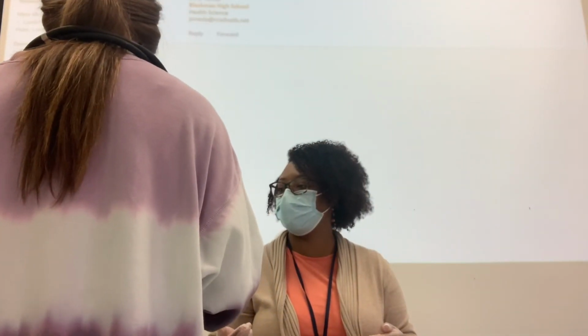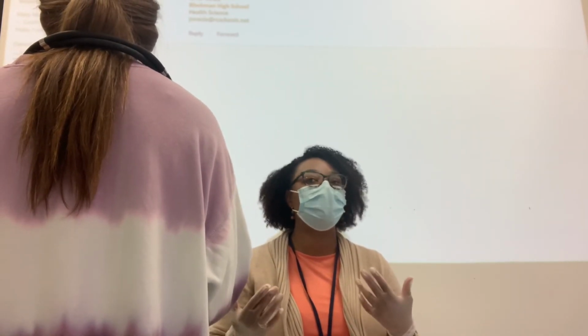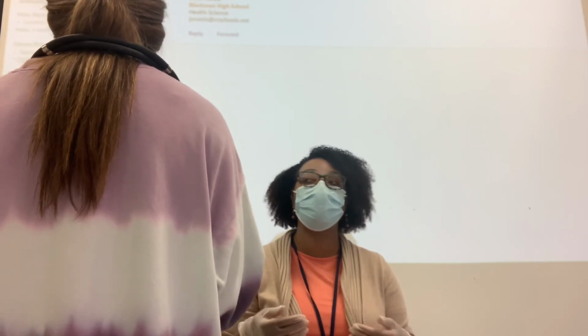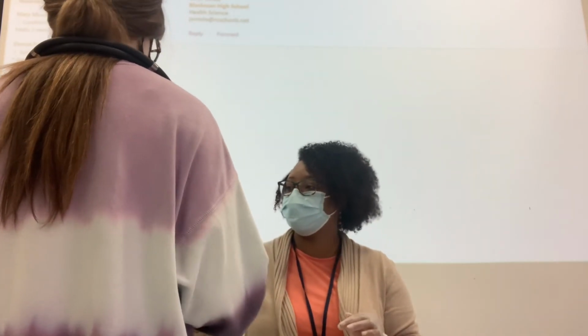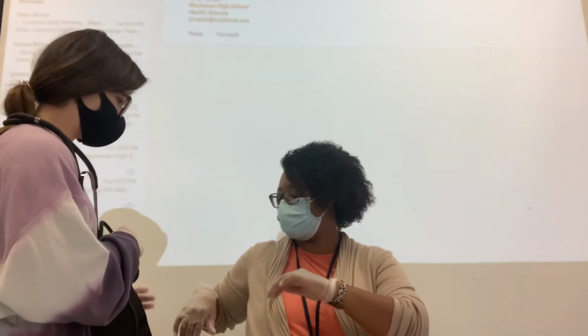All right. So we already have all of our stuff together. And remember I said you have to make sure you have the correct size. So if it's falling off of your patient, they may need a smaller size. But for the ones that we have, I want you to try to put it on a little snug, so that it doesn't start turning around on you. All right. So turn sideways so they can see a little bit.